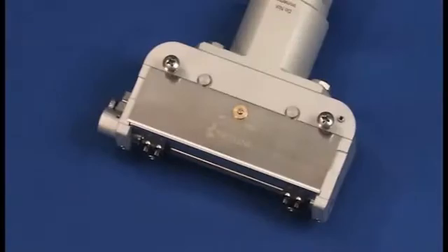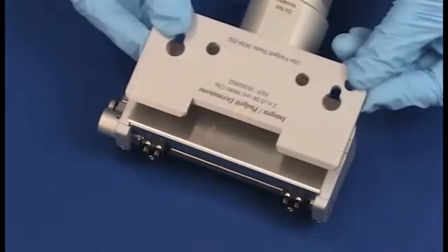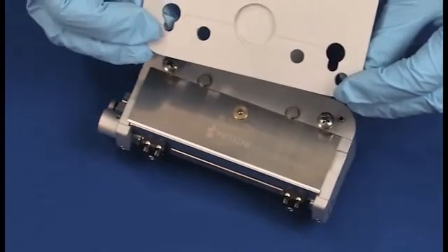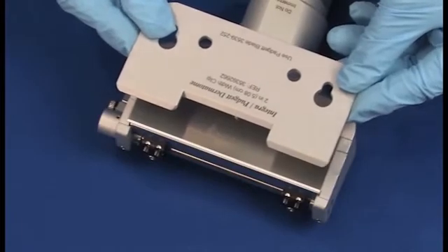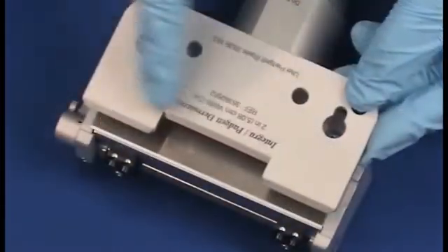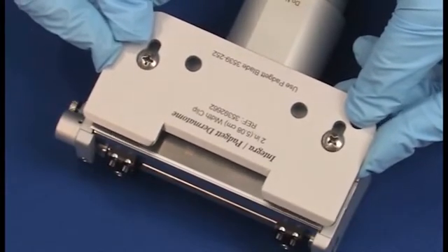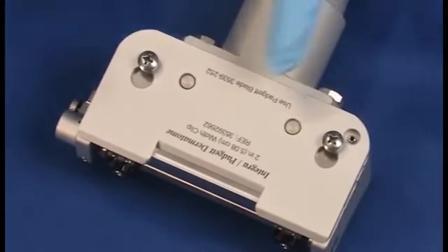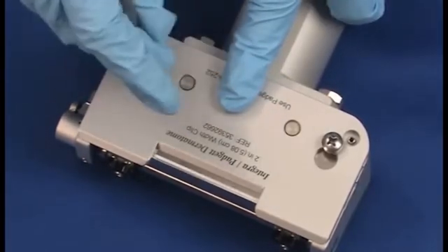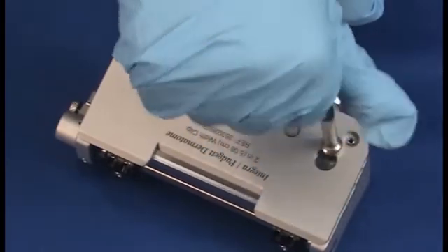With the blade in place, select either the 2, 3, or 4-inch width clip and check to see that it is also free of lint or foreign matter that would restrict the free movement of the blade. The beveled edge of the width clip should be facing forward and should be flush with the head assembly. The width clip is then placed on top of the blade and screwed into place with the screwdriver. The clip should be snug but not extremely tight.